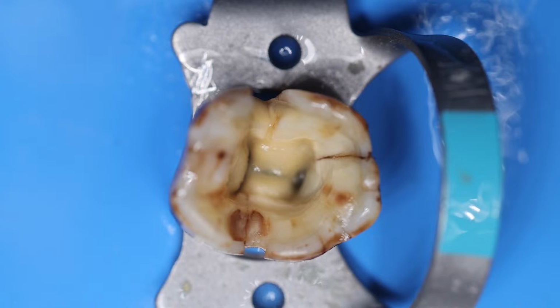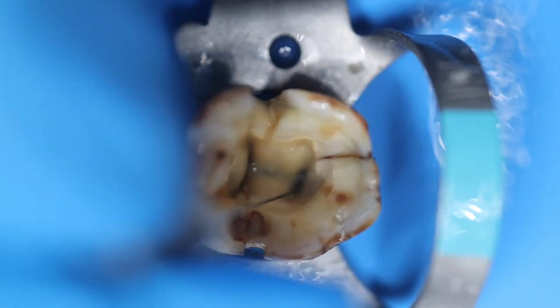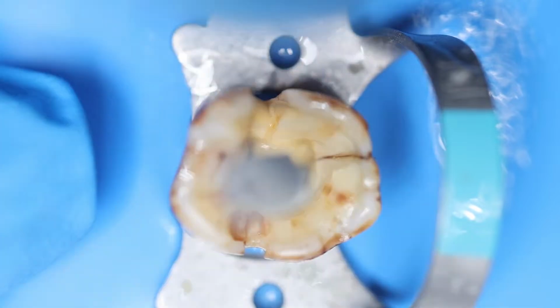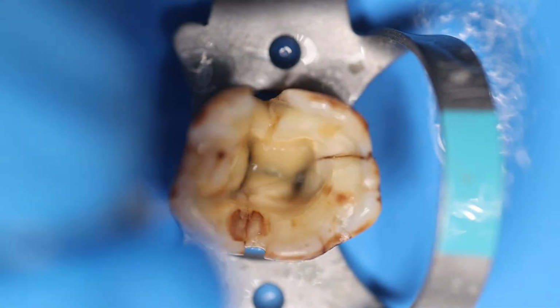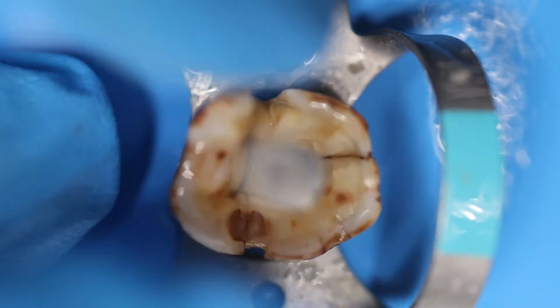Okay. So suppose we are using this 8K file in a distal orifice. See, the file should get engaged into the distal orifice like this, and there should be a resistance from the walls. So this will help you understand that there is no perforation, there is no profuse bleeding from the canal.